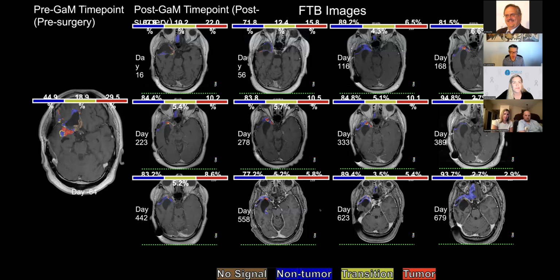In those cases, you would probably have to extend RCBV into the non-enhancing tumor as well, because most of the tumor or areas of abnormality will no longer enhance. Most of our studies have not looked at the setting of Avastin, and so it's difficult for us to really extend it in those scenarios.